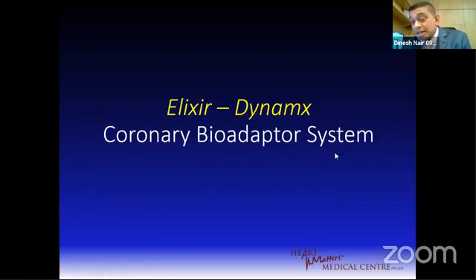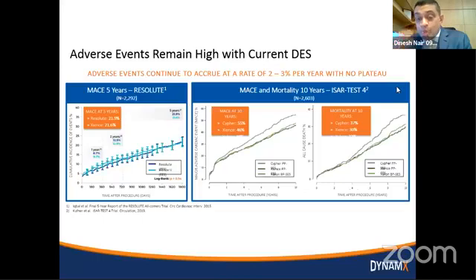And the next one that I'd like to demonstrate is actually a very new stent. So we've not started using this, but as of next month, it'll be approved, hopefully, in Singapore for use. There have been some use in Europe and some studies as well elsewhere. It is a stent, after all, and a stent is a scaffold that you can open up. In the past, all we had were balloons. We moved on to stents, and now we're getting better and better stents.